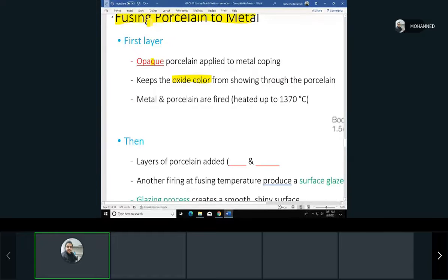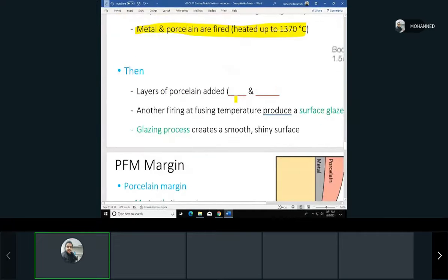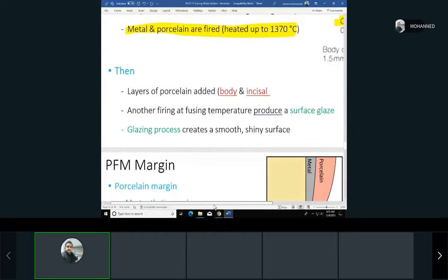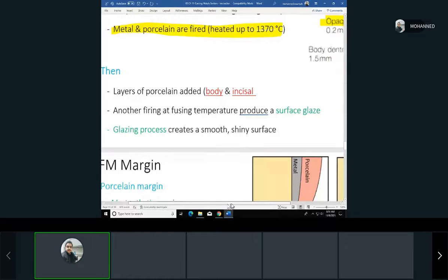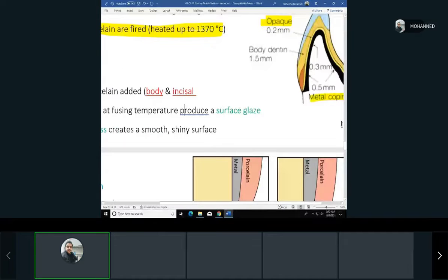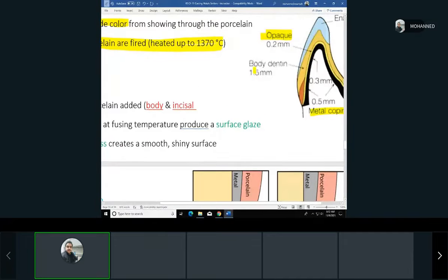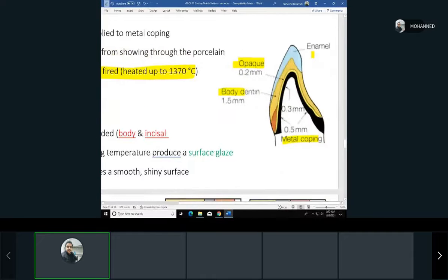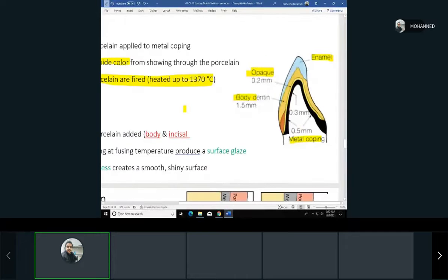Then what we do, we fire it, which means heating it up in the oven. We take it out, and then we add two more layers to it, which are the body and the incisal. Sometimes they call it the enamel part. And these are the ones that will make up the tooth shape and color also. Again, you can see it in the picture here. So we have the metal coping, we have the opaque part, and then you have the body, and then you have the incisal, which in this picture they call the enamel. So it's multiple layers of making a porcelain fused to metal.